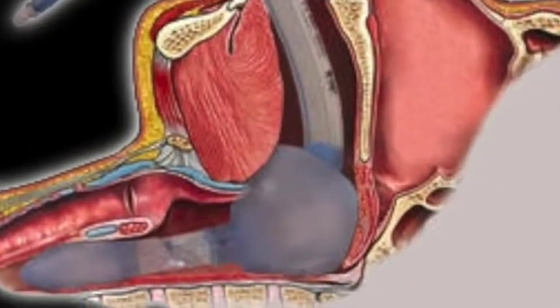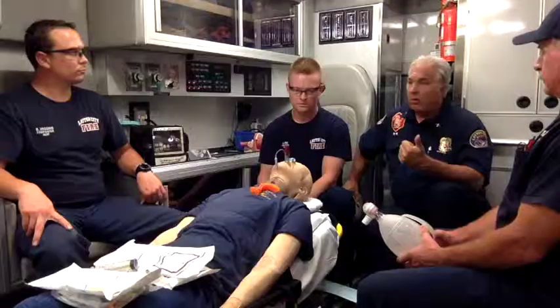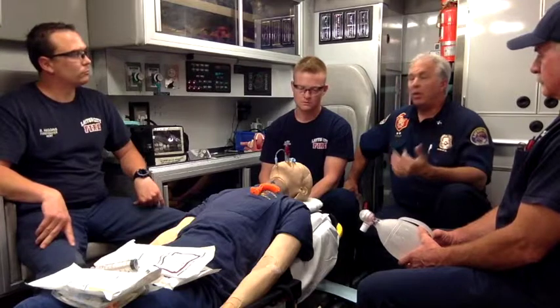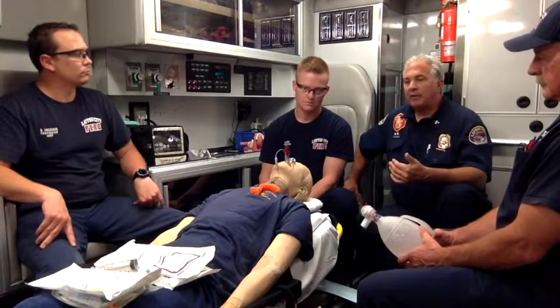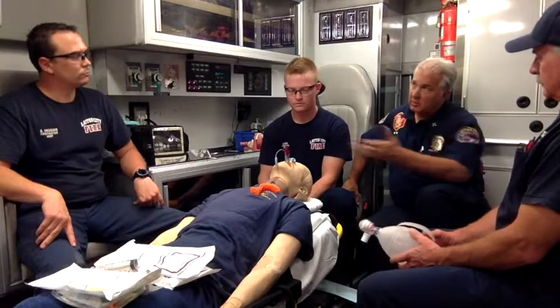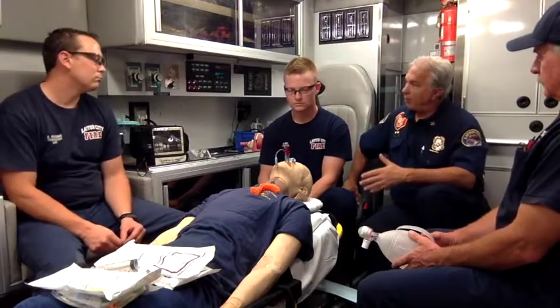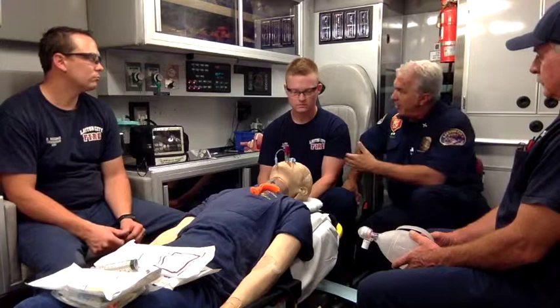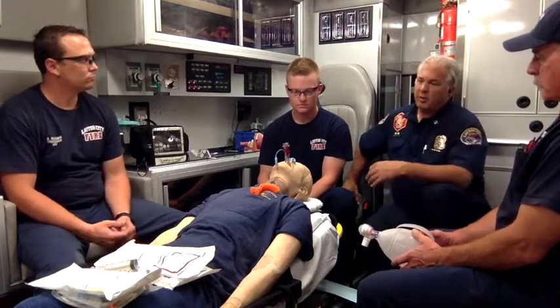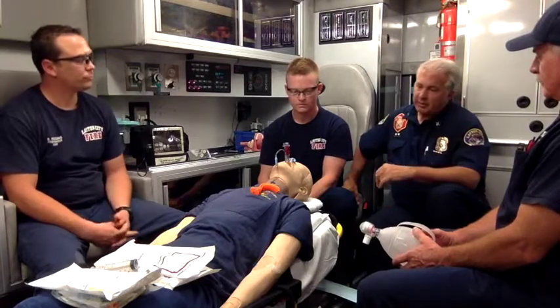And if you had what I would always refer to as a no-flow, low-flow state, so perfusion, blood pressure, moving blood to the brain, it was tamponading blood flow to the brain. And so maybe these things weren't the best thing to use, especially in a no-flow, low-flow state. So we still could in that trauma patient, as long as they had blood pressure, the overdose patient or whatever, but maybe not in a cardiac arrest.